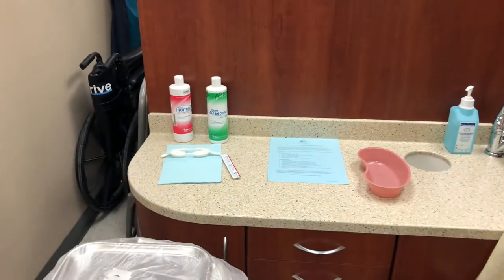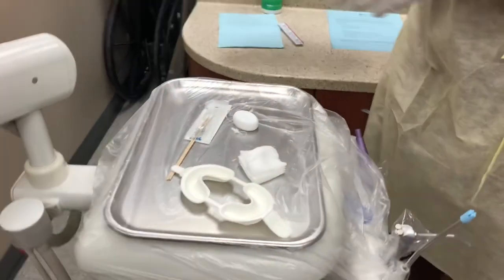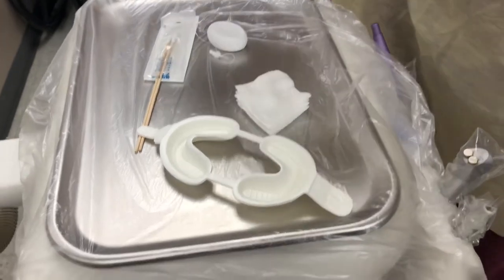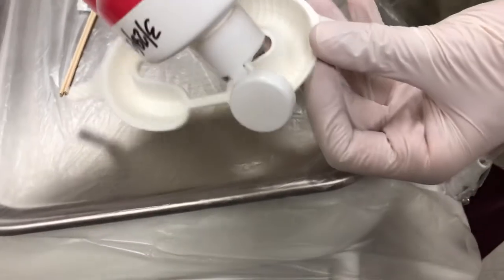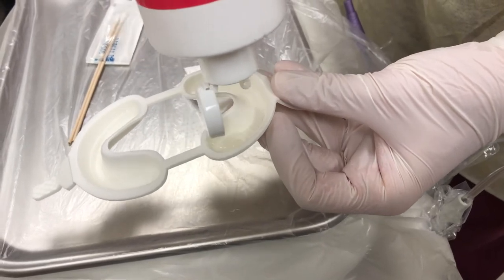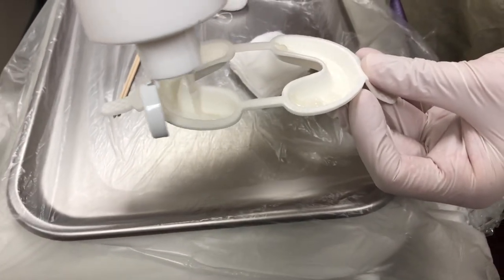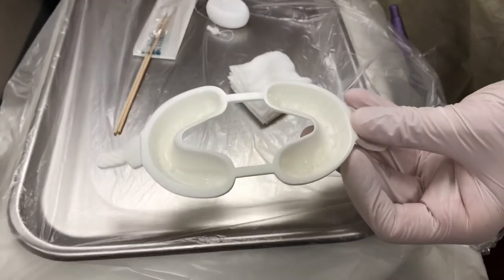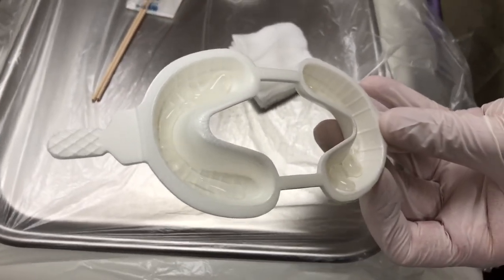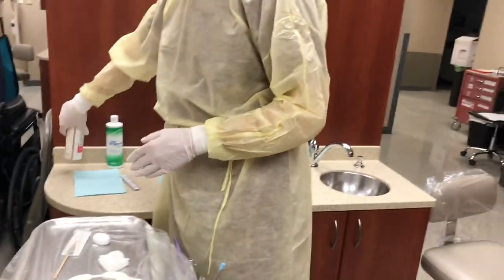Now we're going to demonstrate the amount of fluoride that would be placed in the tray. This would typically be done by dispensary rotation if we were in clinic. Think of a spaghetti noodle — that's about how much you'll want inside. It's hard to see because it's clear, but that would be your placement of fluoride for the tray, and this concludes the tray fluoride procedures.